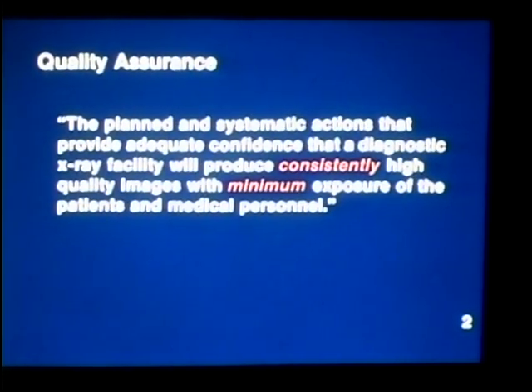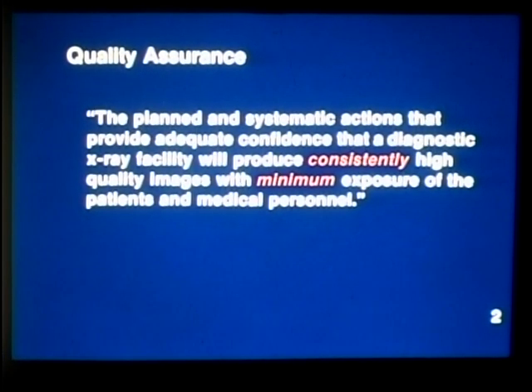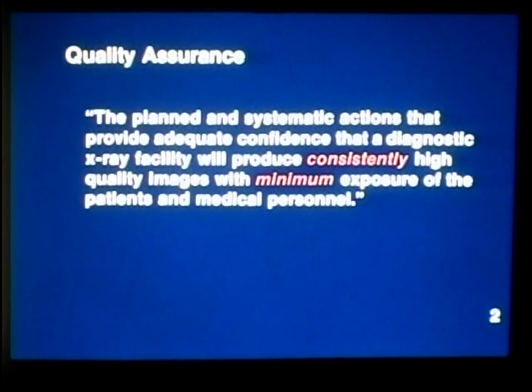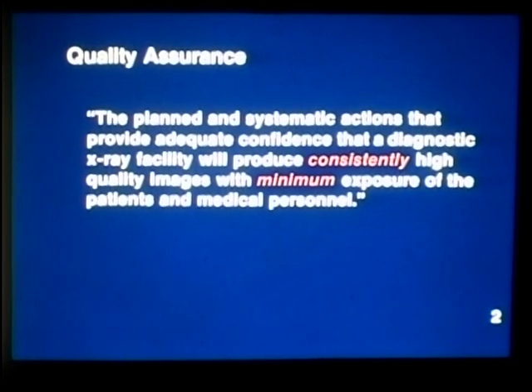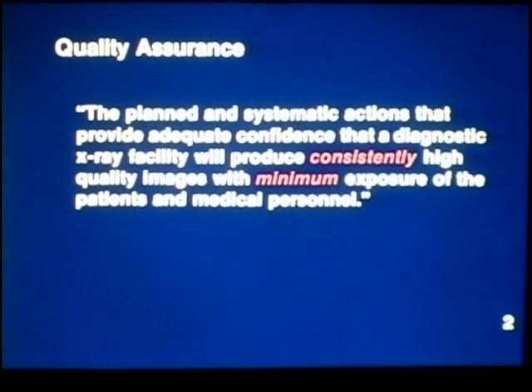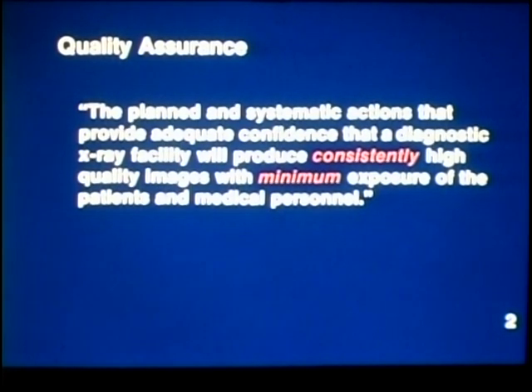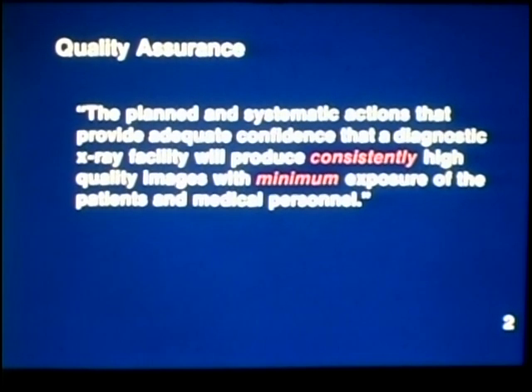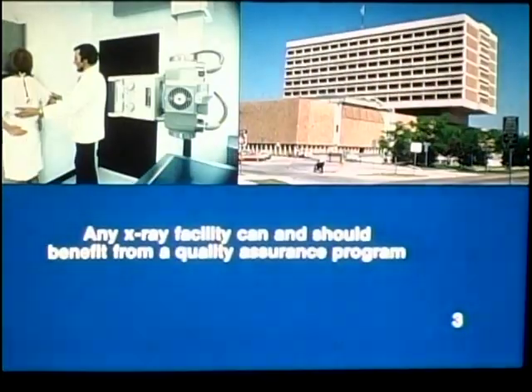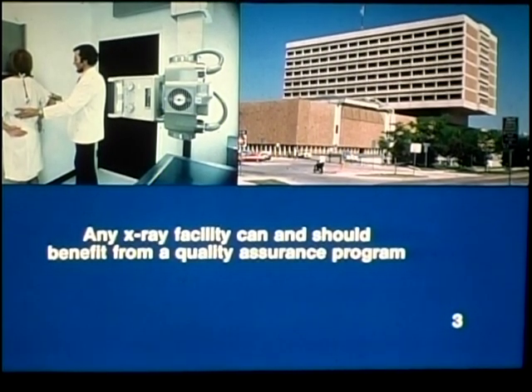Number 2. A simple definition of quality assurance is the process of ensuring that a product or service has achieved a certain degree of excellence. Definitions relating quality assurance to a radiology facility are more extensive, though. The Federal Register of April 28, 1978, defines quality assurance as the planned and systematic actions that provide adequate confidence that a diagnostic X-ray facility will produce consistently high-quality images with minimum exposure of the patients and medical personnel.